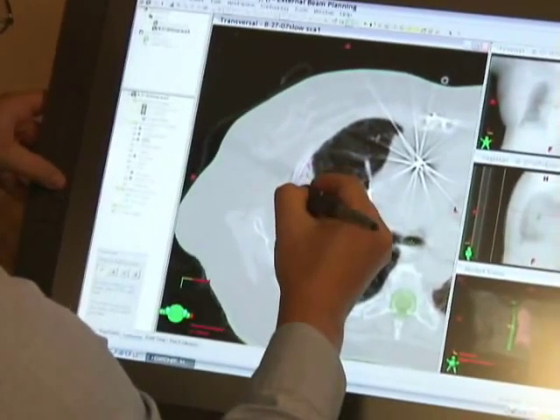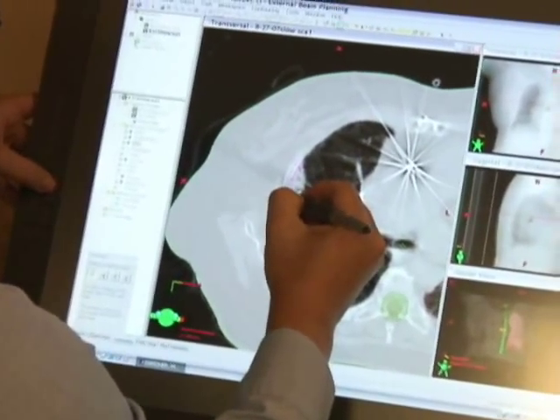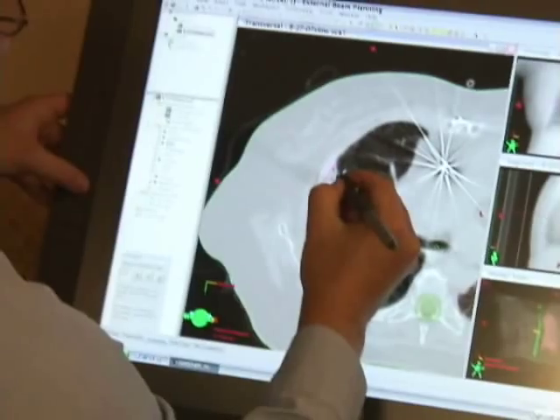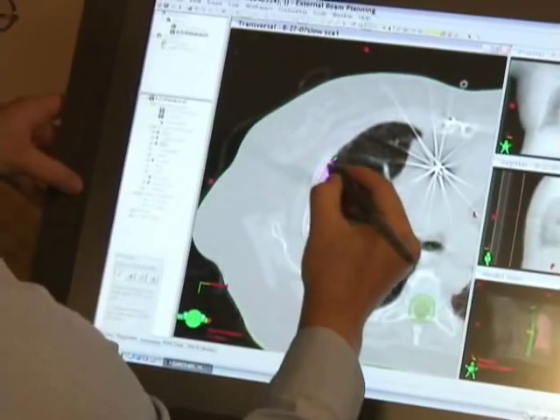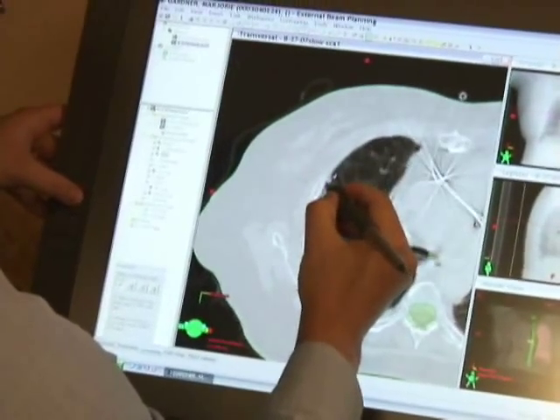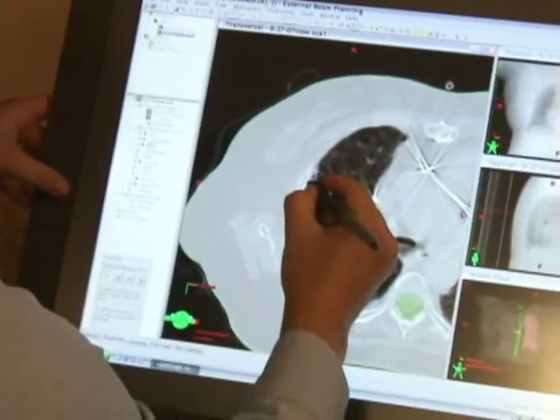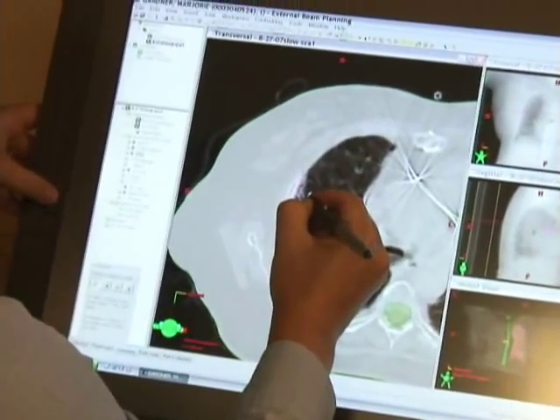We'll usually go every other slice, interpolate, and then go back through the slices to make sure I didn't miss anything.